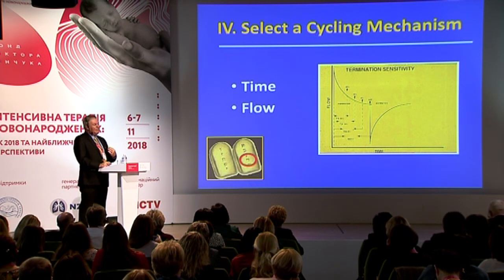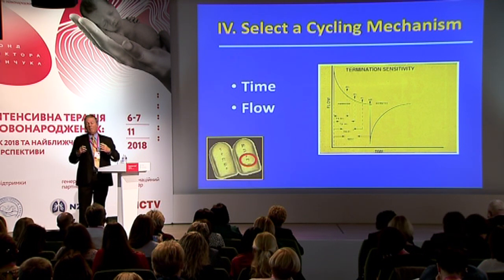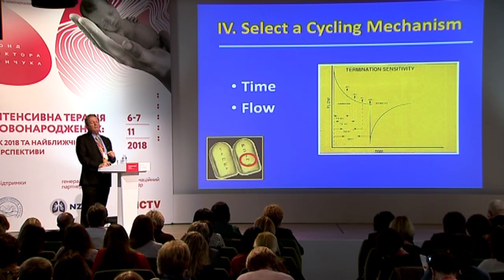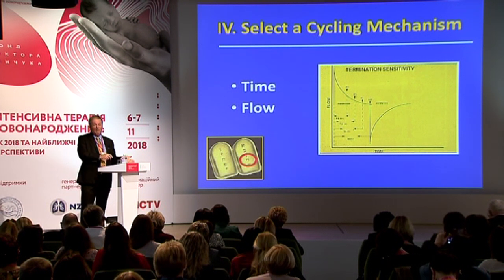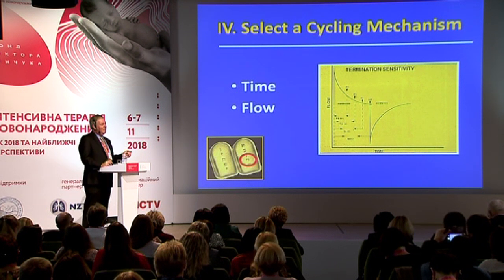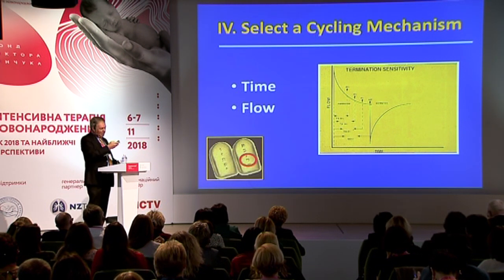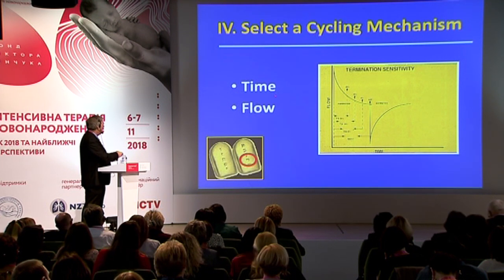And what happens with time cycling is if you say to the ventilator, I want the inspiratory time to be a half a second, when the breath begins, the pressure is delivered to the baby, and exactly after a half a second, the exhalation valve opens and the breath is discharged. And time is on every ventilator. It's also the backup system for the alternative way of cycling the breath, and that's by using airway flow.